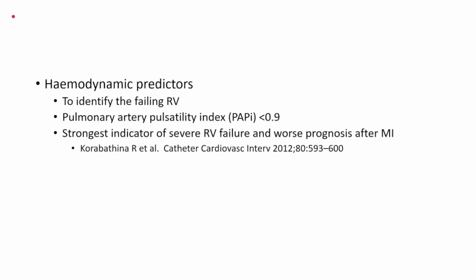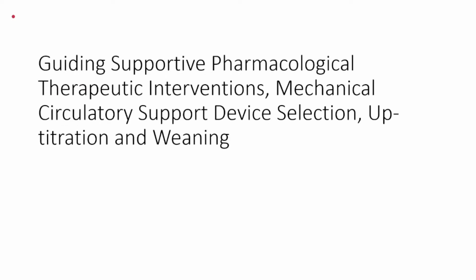Honestly, my personal experience, I would like to clarify, is more with cardiac surgery in the OR. In just the last 4 or 5 years, we are using the Swan-Ganz to classify our heart failure patients for selection of devices. So our experience is still coming up. We don't have a lot of evidence from our institution and literature also. These are observational trials which are giving us these numbers.